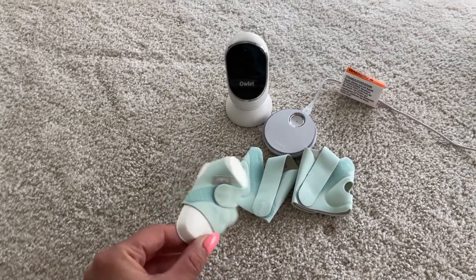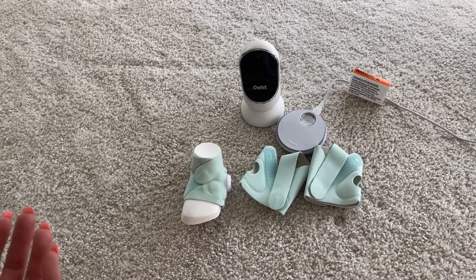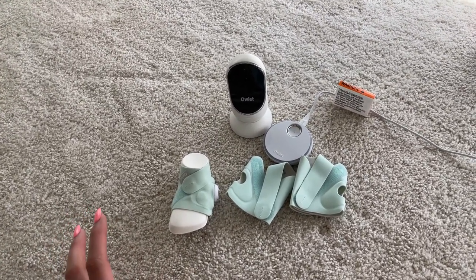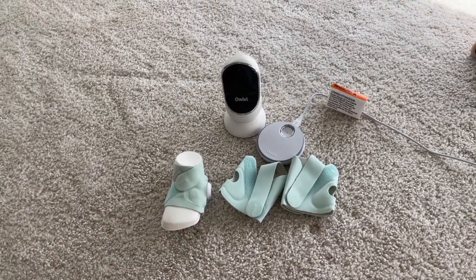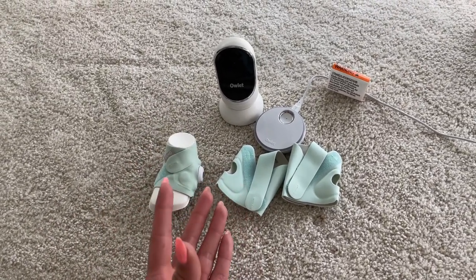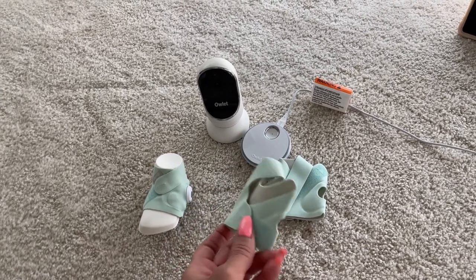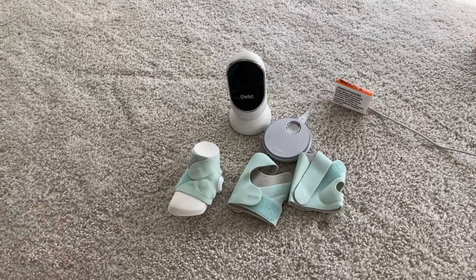I love this — knowing that my baby is okay, that my baby is breathing throughout the night, just gives me peace of mind and I can sleep a little bit longer without worrying about her. Definitely check this out and see if it's a fit for you. I forgot to mention they also come with different sizes of socks, so you can use this for a very long time. I love this brand 100%.